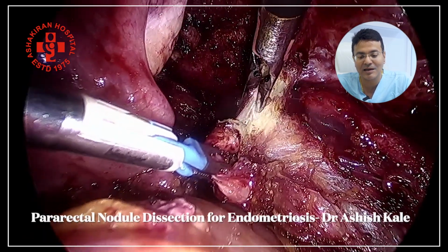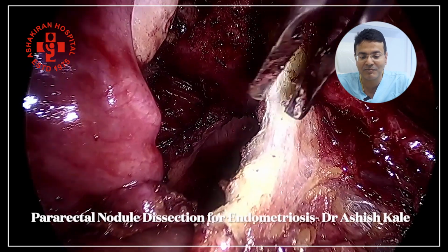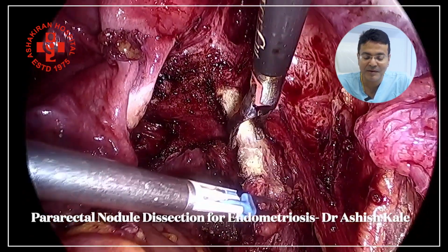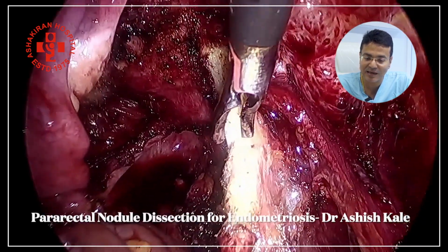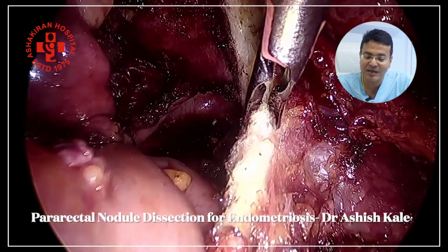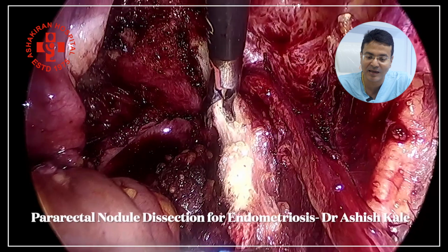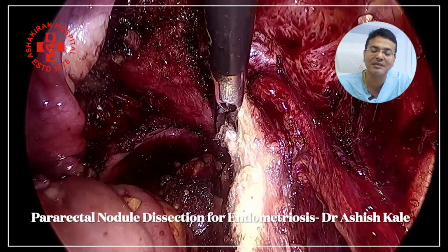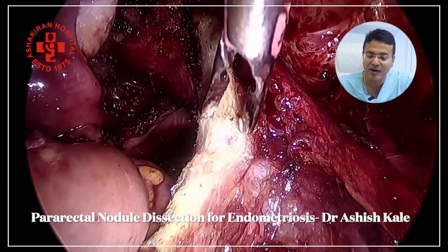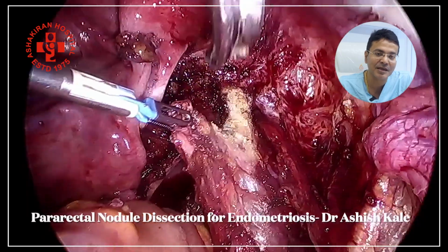With the ureter in your vision, you can start dissection down. Now the normal tissue comes up, and once the normal tissue is observed, we are just going to dissect the already dissected pararectal spaces down. This is the uterosacral. Now after the parametrial nodule, we are going to dissect out the affected uterosacral ligaments, and this is the uterosacral ligament where we are taking it up with the bipolar shearer, and the dissection proceeds further. Once the dissection is in a proper plane, usually when you are in a normal plane, the cutting mode of the shearer will be easier.